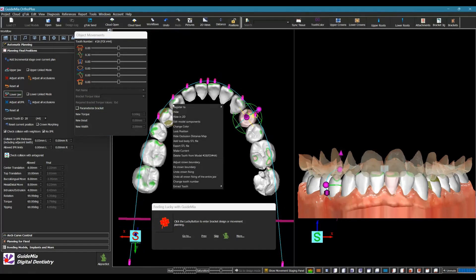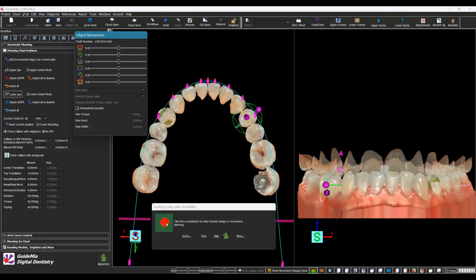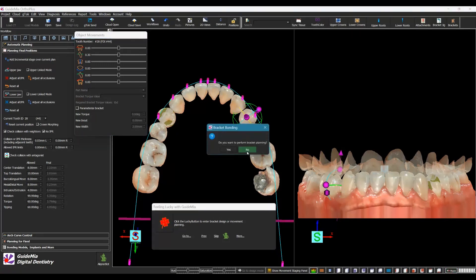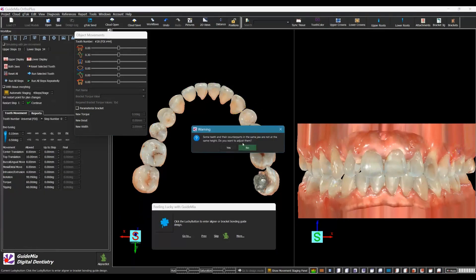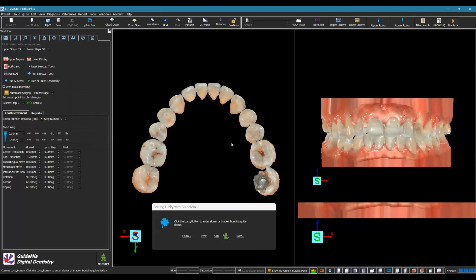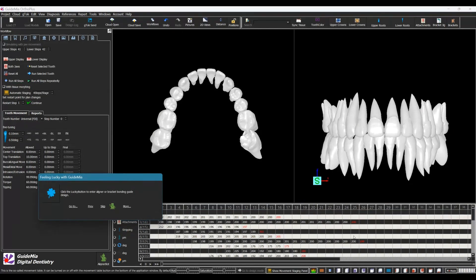If everything is good, we continue. Let's turn on the audio guidance again. We don't do bracket bonding here — click the Lucky Button to enter aligner or bracket bonding guide design. Before going to the aligner model design, we can do a bit more planning. This is the movement table, which can be turned on or off with the movement table button at the bottom of the application window. The rows correspond to teeth and the columns to steps.